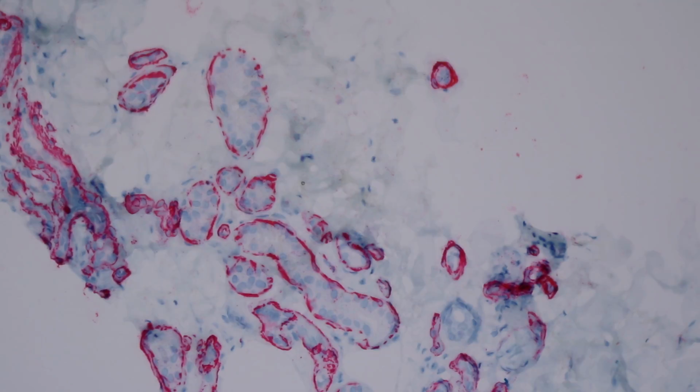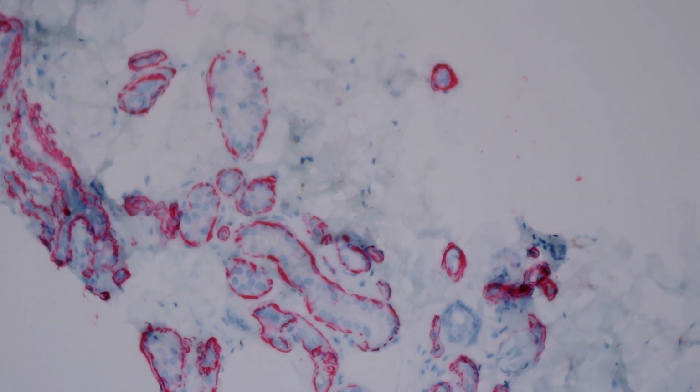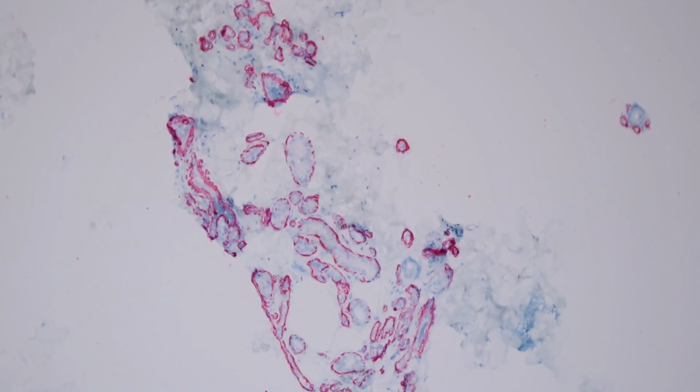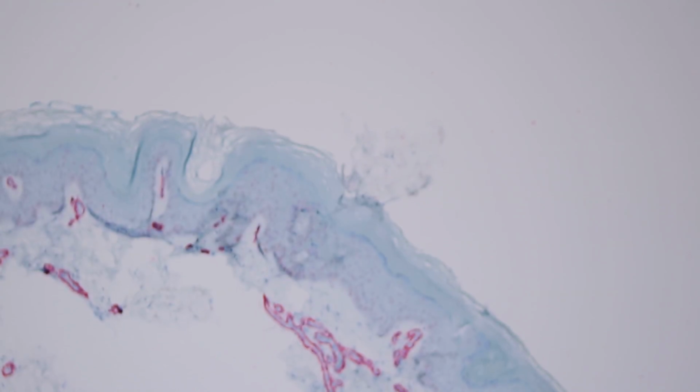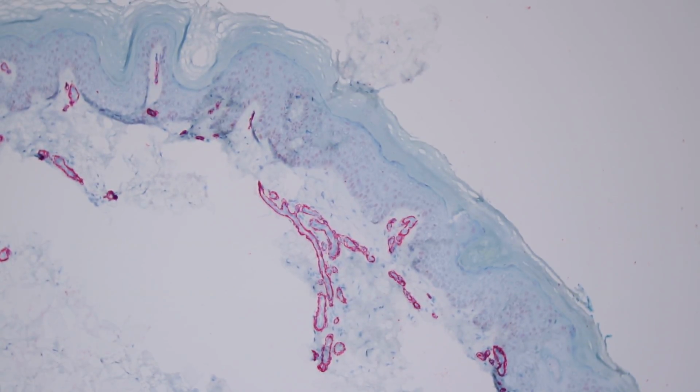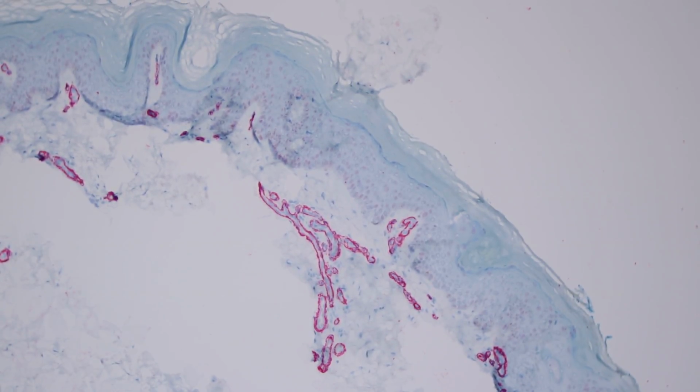Now, actin is not a great stain for myoepithelial tumors in the skin, unfortunately, and that's a whole other complicated discussion that we'll have to save for another day. But normal myoepithelial cells in the basal layer of the eccrine sweat coils actually really nicely stain with smooth muscle actin much of the time. So that's actin staining in the myoepithelium, in the basal layer of the eccrine coils, and in the erector pili muscles, and also in the muscle of vessel walls and the pericytes around small vessels. Smooth muscle actin.